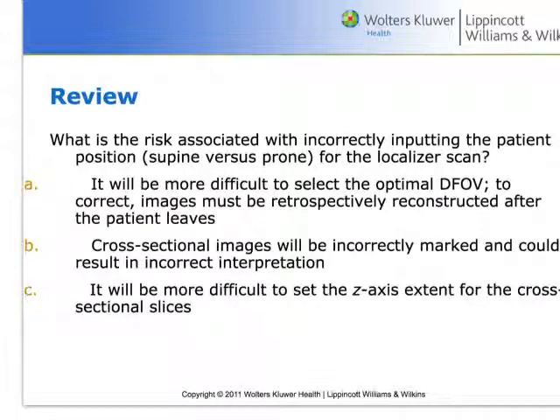And so we pose a real risk, for example, if there's a lesion in the right kidney, they could say, oh, a lesion in the left kidney. Now they're biopsying the left kidney. It comes back negative. The patient's told they don't have cancer when really they do. All right, so this is a significant thing to consider.